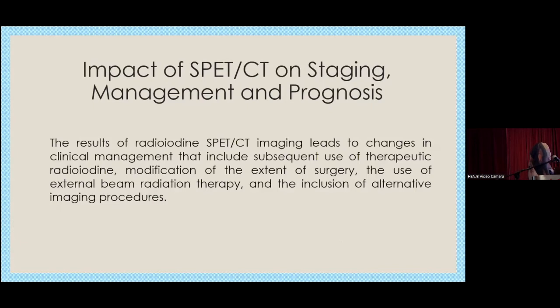So the results of radioiodine SPECT-CT imaging lead to changes in clinical management that include subsequent use of radioiodine, modification of the extent of surgery, the use of external beam radiation therapy, and the inclusion of alternative imaging procedures.